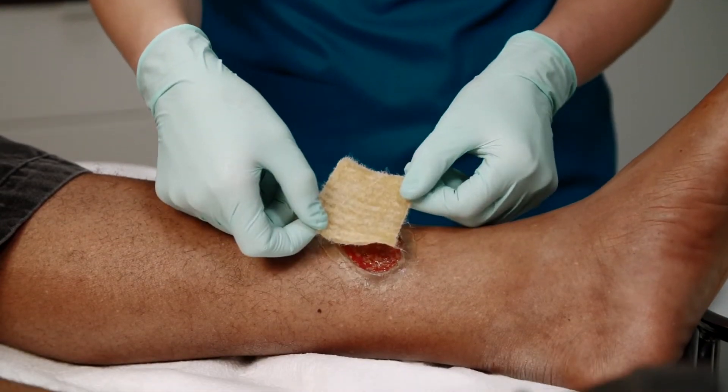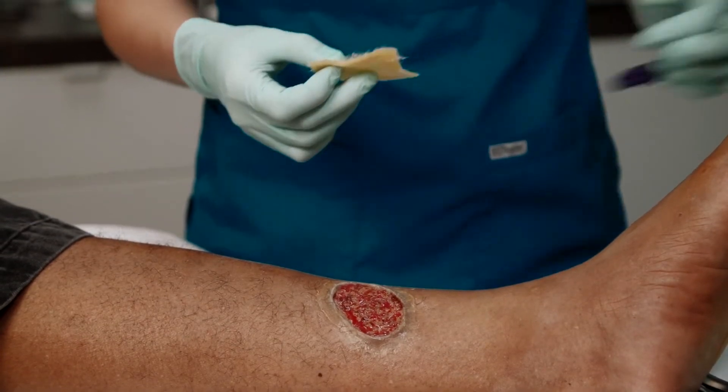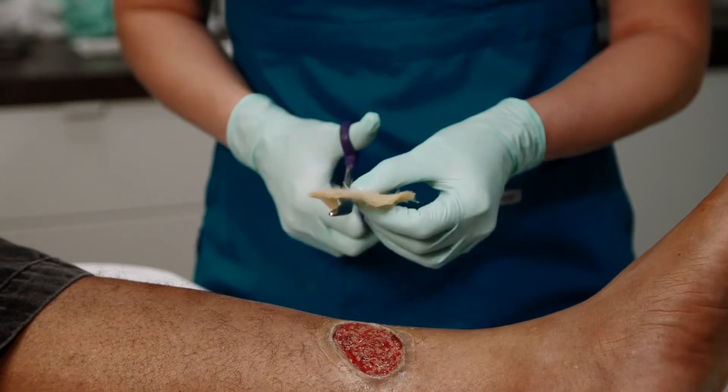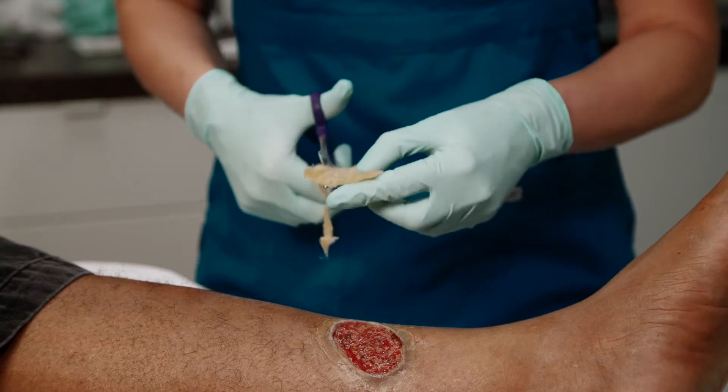Before cutting, assess the correct size needed for the wound, as you want the product to be completely inside the wound edges and not overlapping onto healthy peri-wound skin. Then cut the dressing to the approximate size needed.